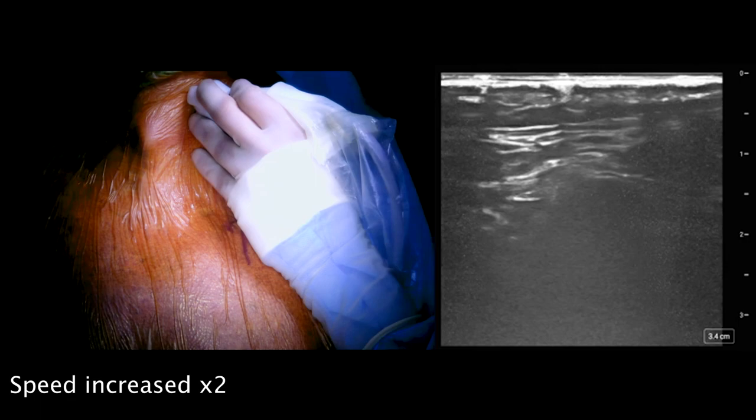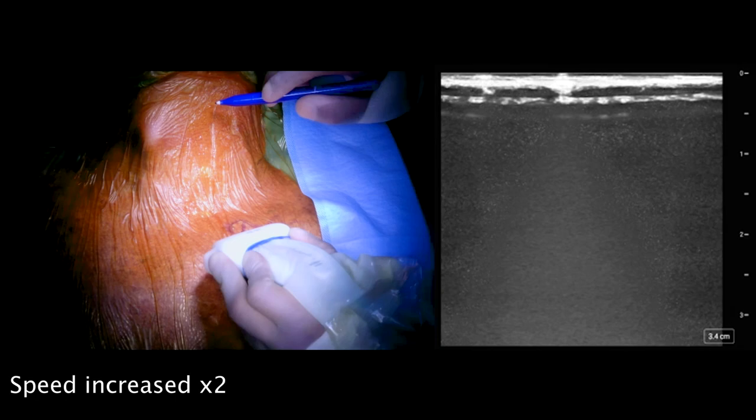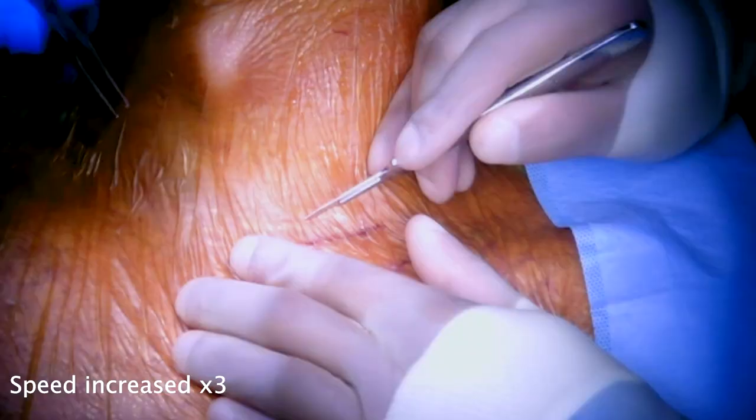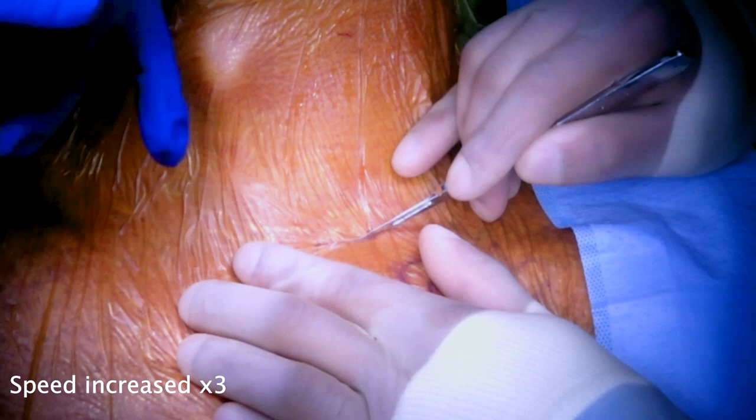The left side of the neck and the right groin were prepped and the patient was draped sterilely. Under ultrasound guidance, we identified and marked the left carotid bifurcation and the left common carotid artery just above the clavicle.